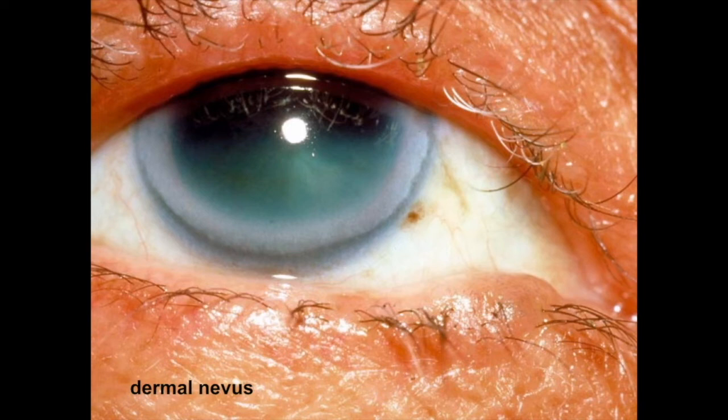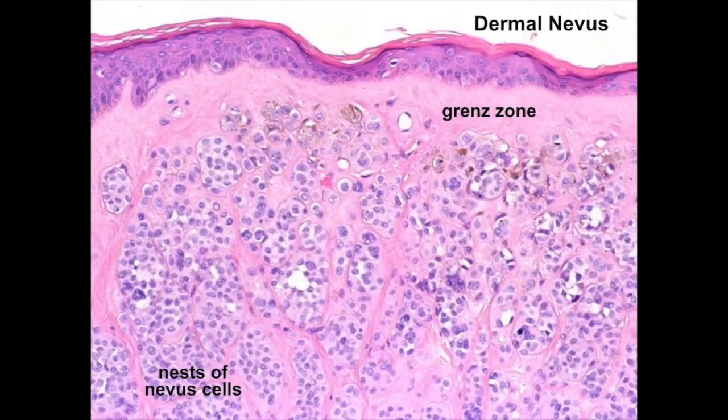Melanocytic lesions. Fortunately, malignant melanomas of the eyelid skin are quite uncommon. We do see a fair number of nevi. This is a dermal nevus from an elderly patient. Amelanotic nevi can occasionally be confused with papillomas. Here's the histopathology of a dermal nevus. There's no junctional component here. There's the Grenz zone that separates the epidermis from the nests of nevus cells in the dermis.